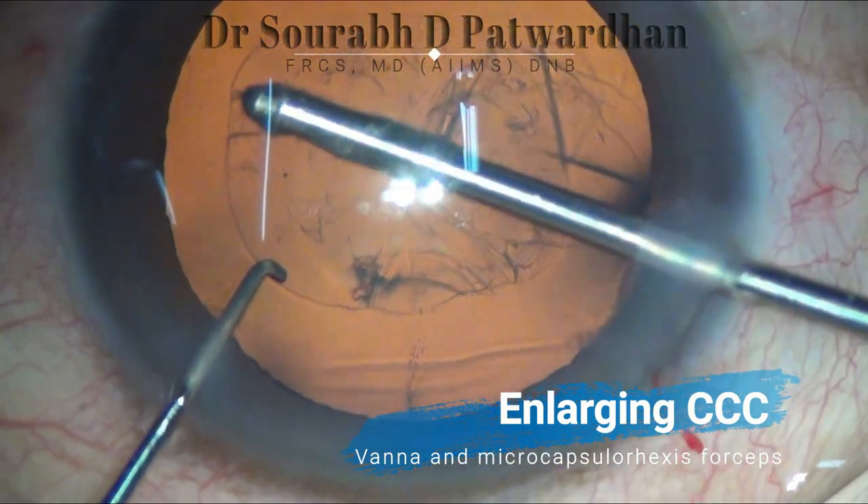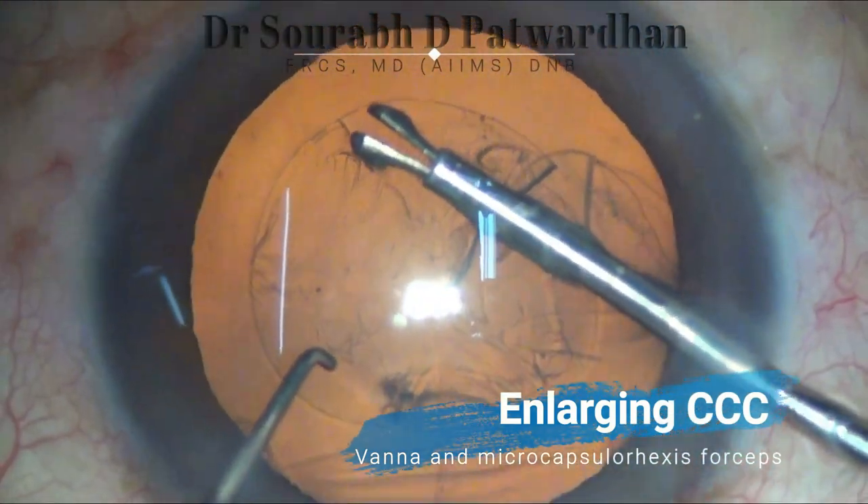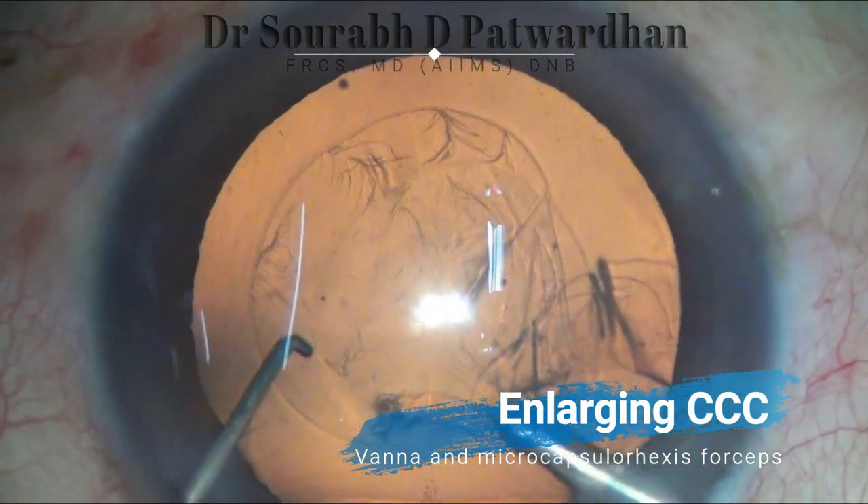Once we have an adequate size CCC, we notice that the number of complications significantly reduces. So it is always important to start with a good size CCC.